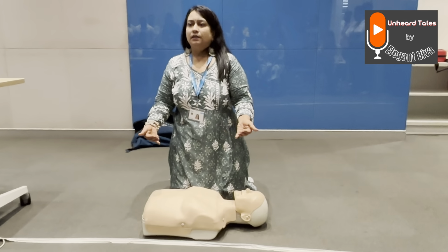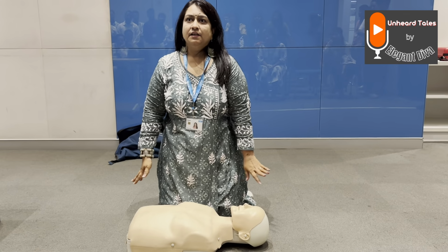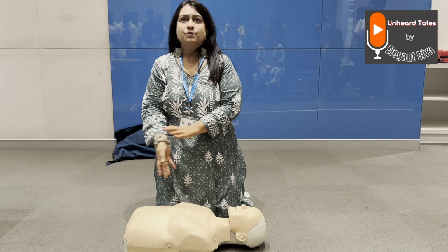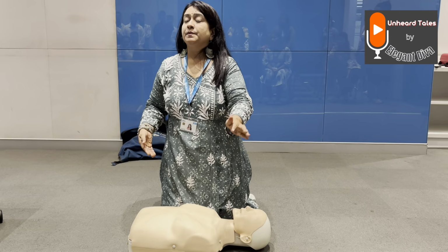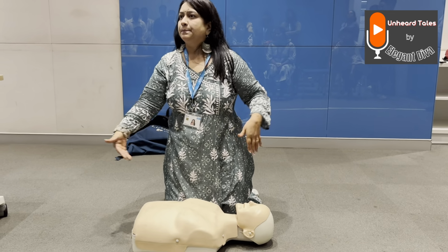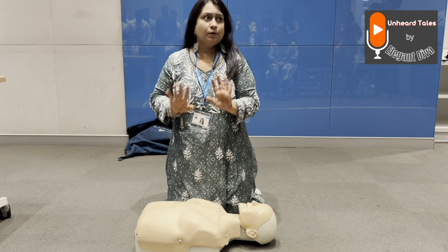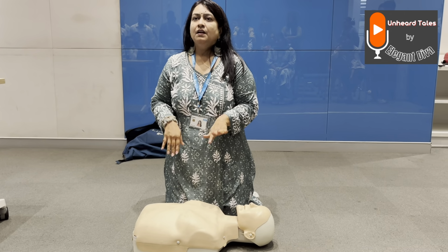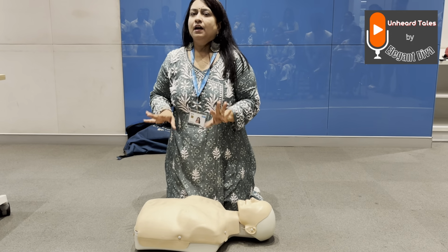Please bear in mind that the surface below has to be hard, because when you're giving compressions, if it's a very soft surface, then the force will not be transmitted. So a lot of times if the person has collapsed on a bed, we try and look for a hard board to slip under. This is recommended for the best result, but sometimes it may not be possible. You have to sit by the side of the person. Which side, right or left? Any side.